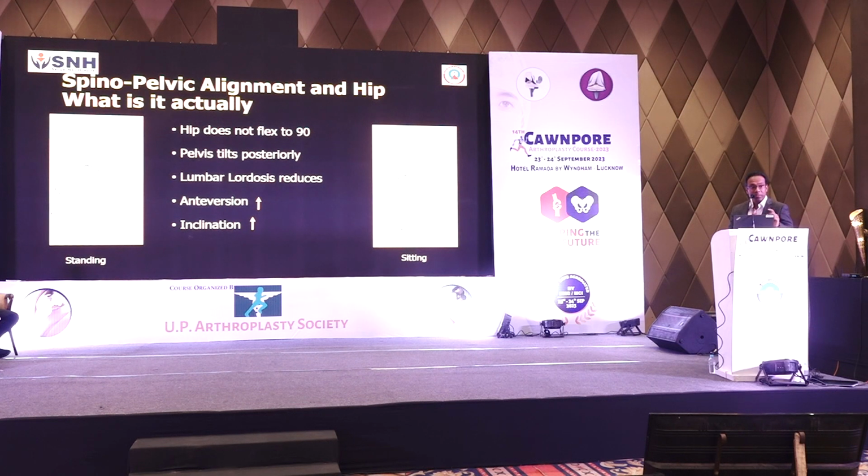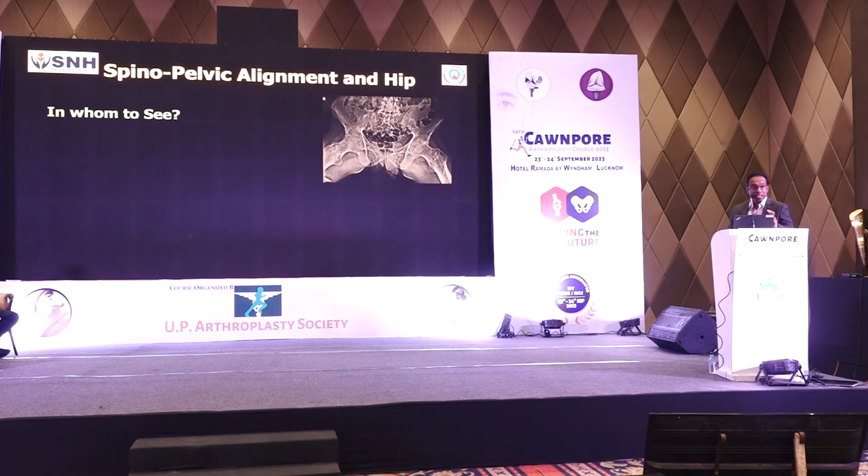You are placing a cup in a virtual standing position because the patient is in lateral and the hip is extended. Once this patient starts to sit down, the anteversion of the cup that you've placed on table, which you feel is wonderful, will change. The inclination will change. The anteversion and inclination will both increase. And at that time, if there is a problem, the cup may dislocate.